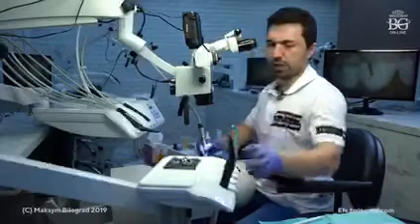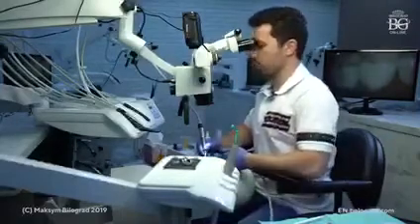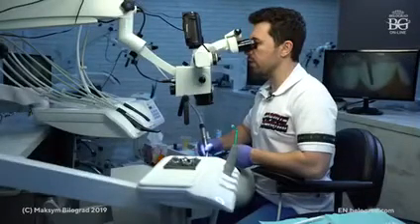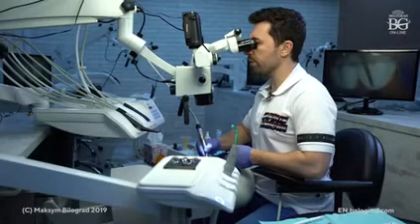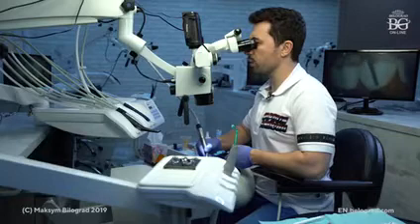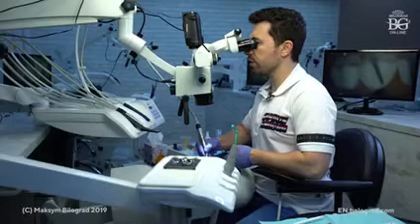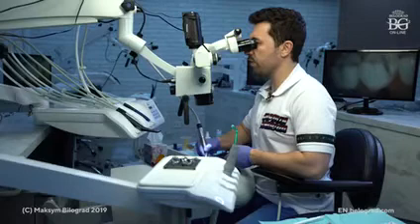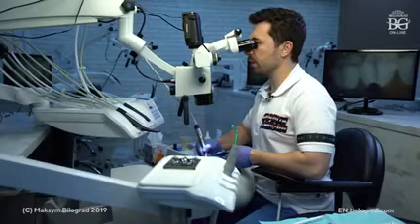One more time, let me just help myself with the air spray because I have some dust on the surface. And also, when your assistant helps you with air, you can visualize better the areas that you work with, because with water spray you have highlights and splashes, and it's pretty difficult to understand the depth of your finish line. But when there is air, everything will be easier.